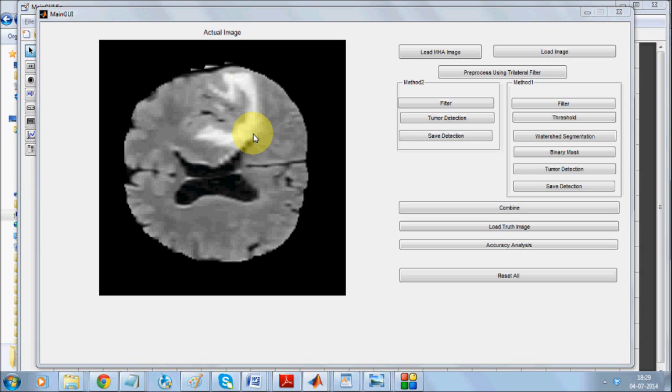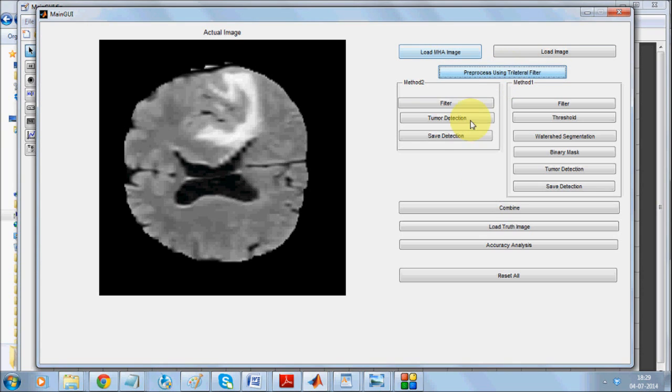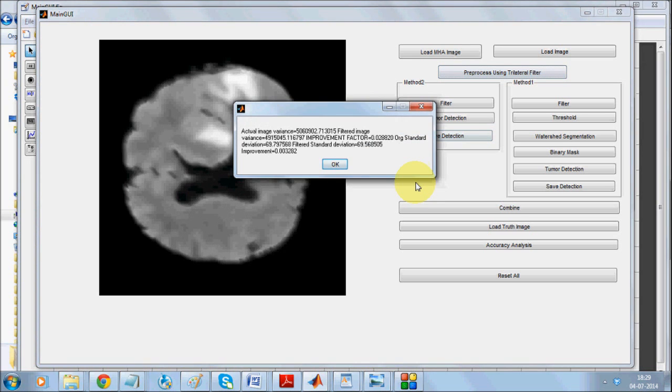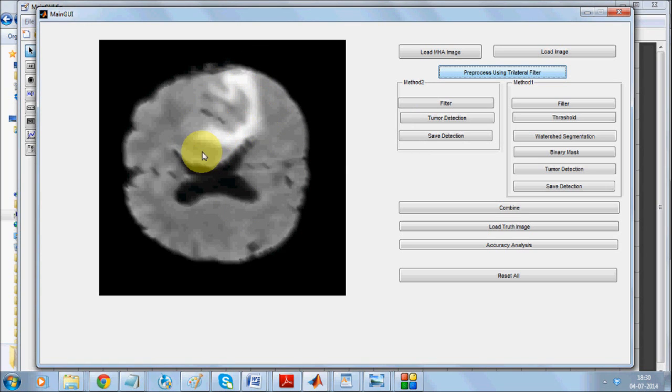Here we are using two different methods. One is EM-based segmentation technique, the other is median filter and watershed segmentation. We are comparing the result of both as well as checking the accuracy of the system with respect to the truth image. Now we'll be preprocessing this using trilateral filter, which has very good accuracy to suppress the surroundings and make the medical part more prominent. The trilateral filter has been kept consistent for all the techniques.